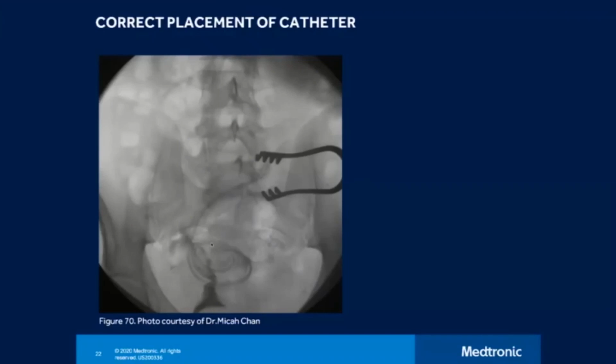I honestly have not used that, but if you can use that, I guess, that's definitely another way of providing anesthesia. In my experience, if you give lidocaine sub-Q, and then we actually have the patient do a Valsalva, and then inject more lidocaine down into the rectus.